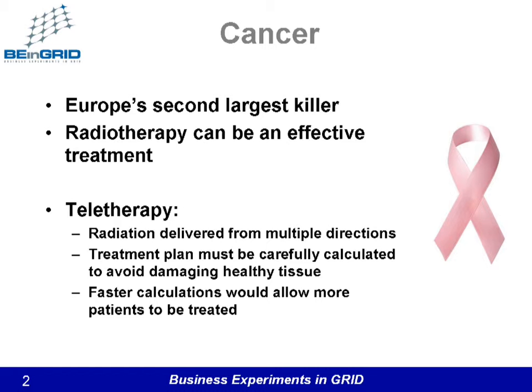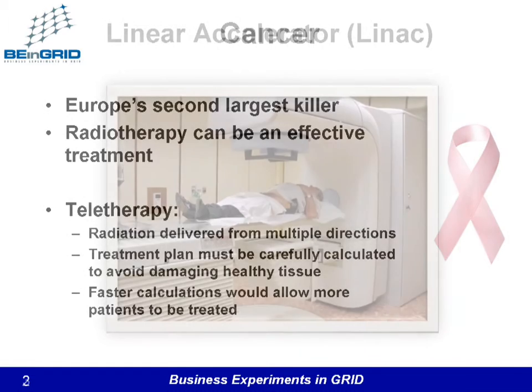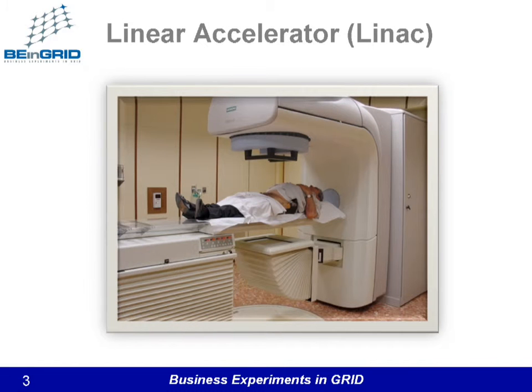Calculating treatment plans can take a long time and involve a lot of numerical computation. Speeding up this process would allow a greater number of patients to be treated. The picture shows a typical linear accelerator, which is used to deliver teletherapy treatments.